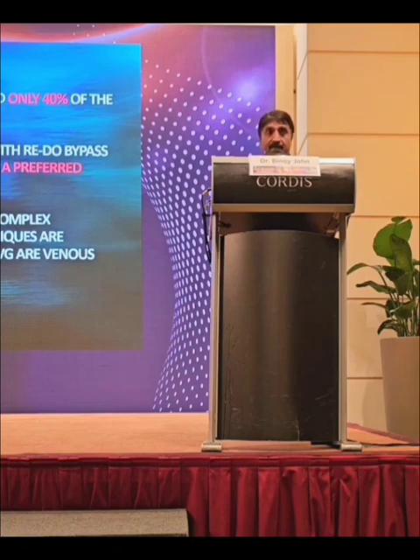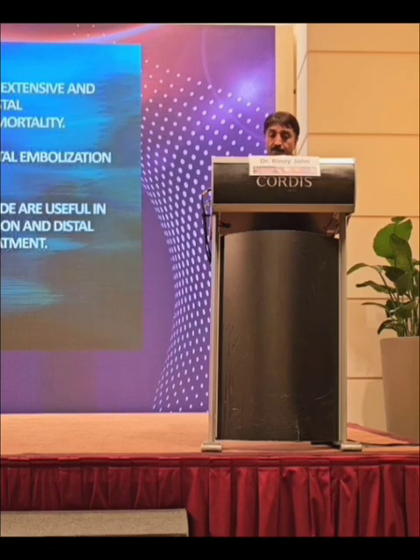So coming to the take-home message, SVG attrition rates can be up to 15% in the first year, and only 40% of the grafts are patent by 10 years. The higher morbidity and mortality associated with redo bypass surgery and damage to the patent LIMA makes angioplasty a preferred option for revascularization. SVG angioplasty is classified as a complex intervention, and strategies and techniques are different from native coronary artery angioplasty, as SVGs are venous conduits.